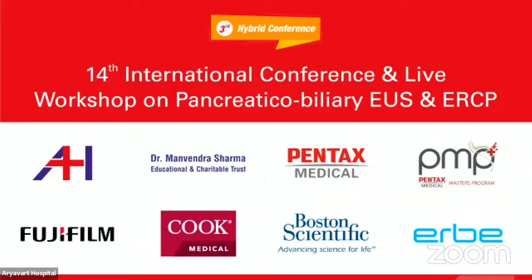She has come for EUS guided gastrojejunostomy, basically for the palliation. She has refused surgical management. And so I would like to request Dr. Pravir Rai to please start the session.